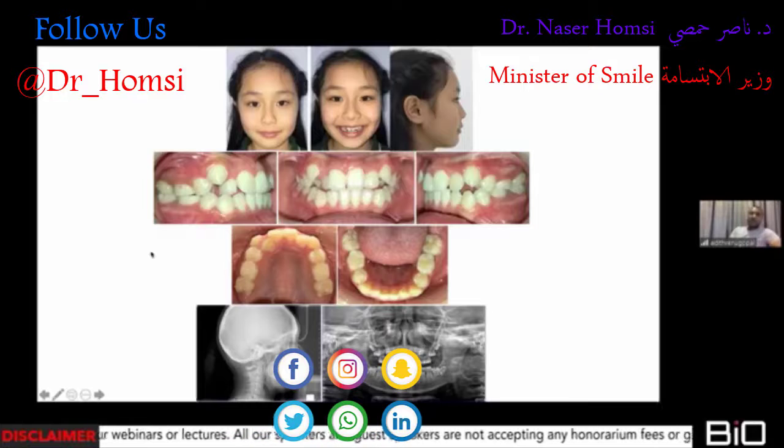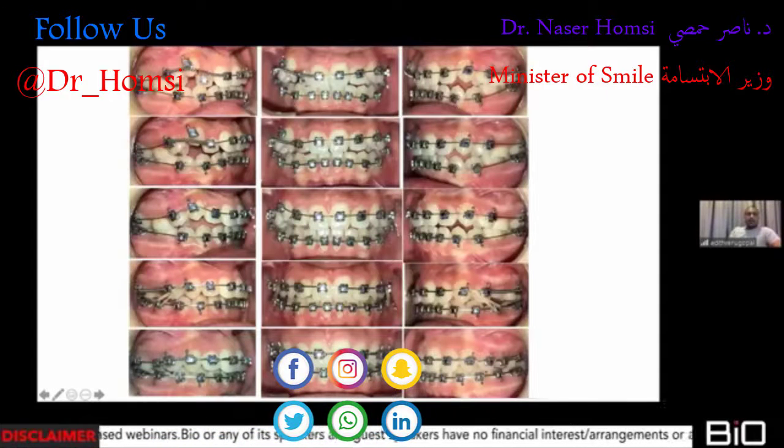She has a good, decent profile, good amount of crowding. As you can see, I have very little space over here to get this particular lateral incisor out. But in this particular case, I made a mistake again to not go the extraction way and to go the non-extraction way, looking at different claims from gurus of non-extraction. And I gave it a go, like I gave it a go in the first case in that girl. So over here, you can see that I had placed an open coil spring, a really long one, because I didn't want to engage the lateral incisor.